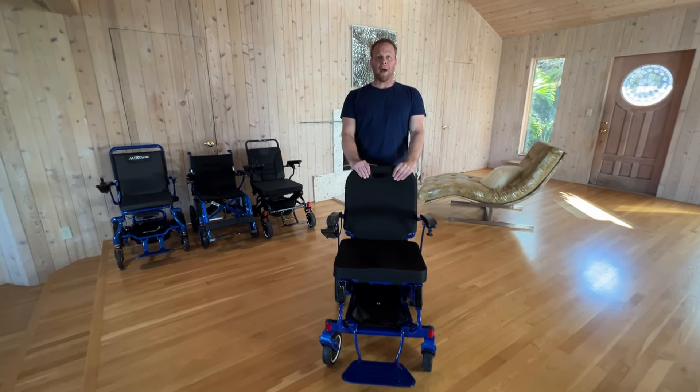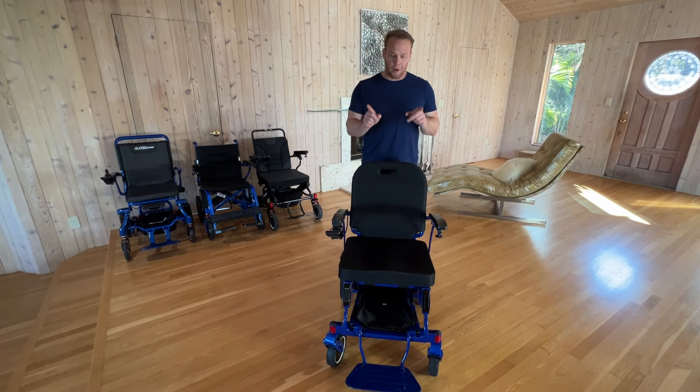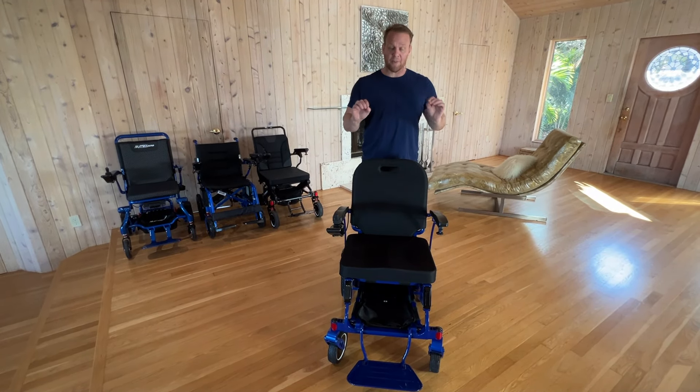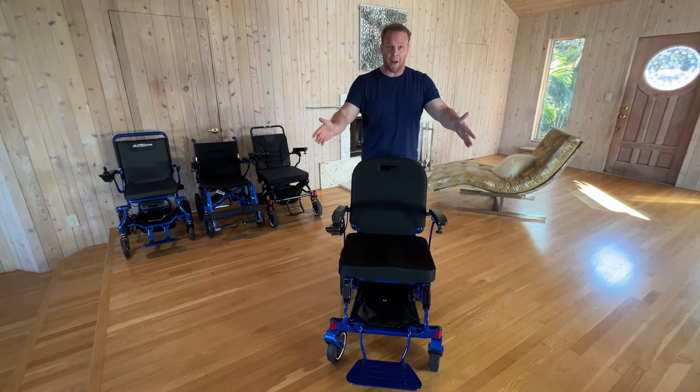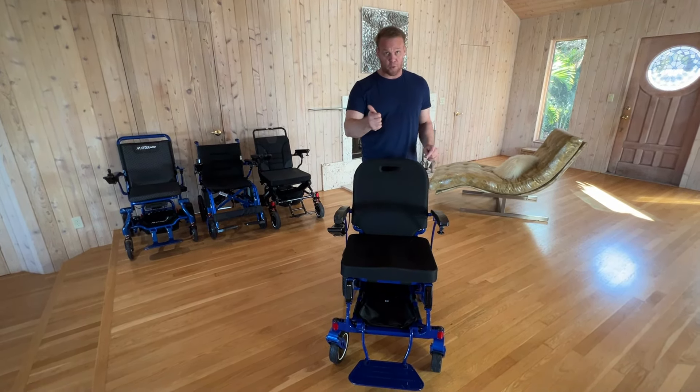Hello, this is Paul from quickandmobile.com and we are here with the Pegasus Plus Carbon Fiber HD chair. It weighs just 50 pounds without the batteries, 58 pounds with batteries, holds up to 440 pounds, and has a remote control.